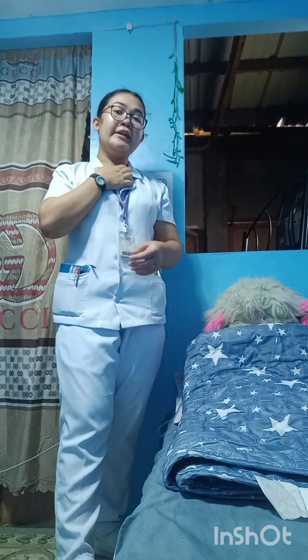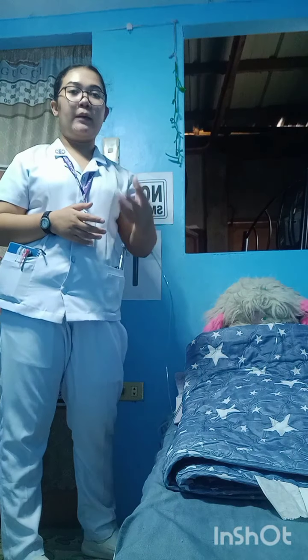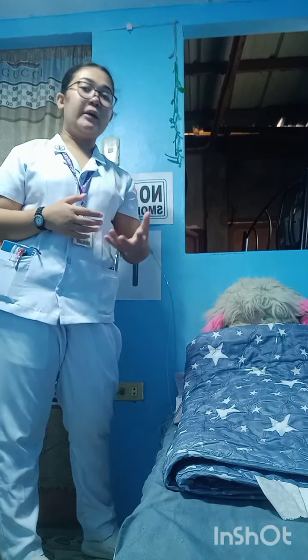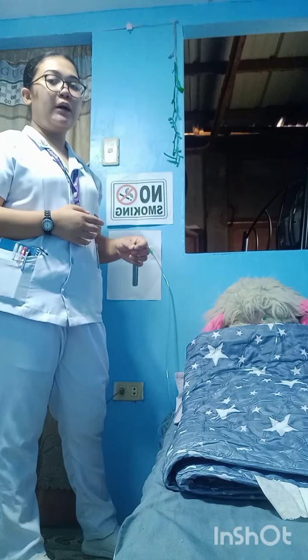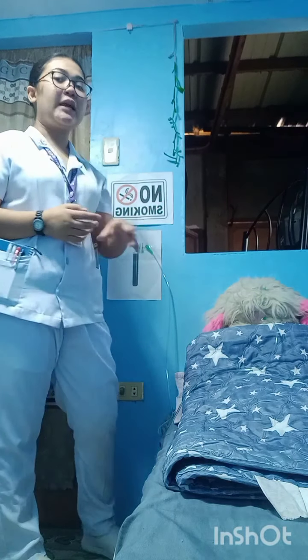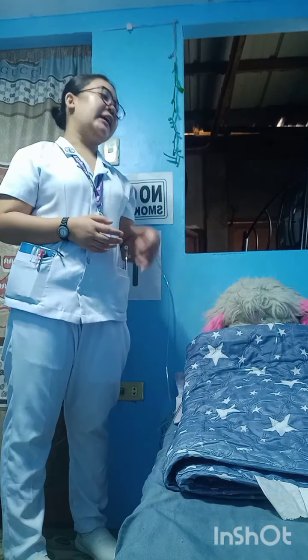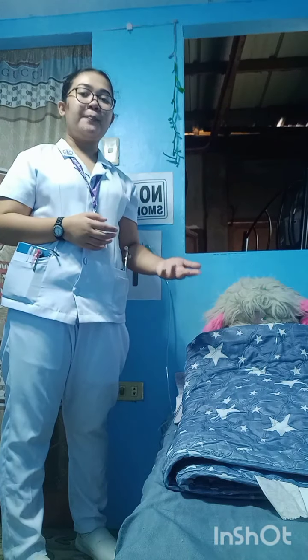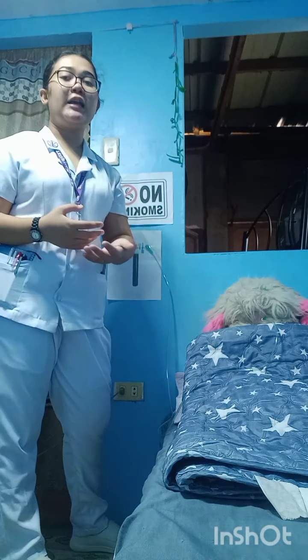Because there are instances na yung mga flow meter ng oxygen natin is nababago or hindi natin namamalayan na nagagalaw ng patient or ng mga watchers or ng family ng patient, lalo na yung mga naku-curious. Kailangan natin siyang i-check para malaman natin na sakto lang yung binibigay natin na oxygen, hindi kulang, hindi sobra, sakto lang.